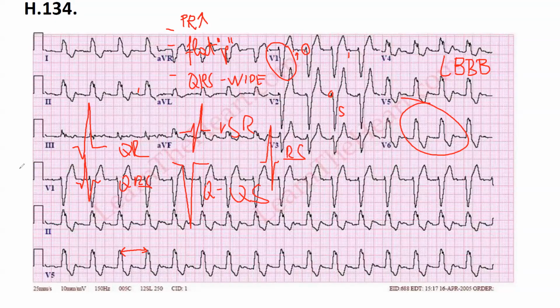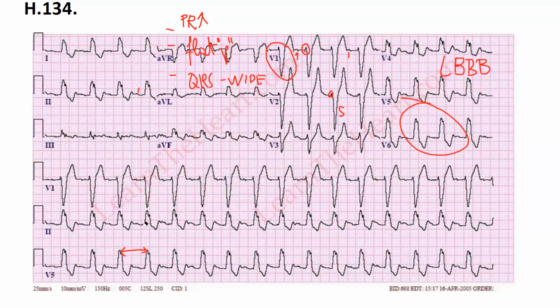I'm happy that you started to study. So it looks like there is no pathological Q wave. Go on.